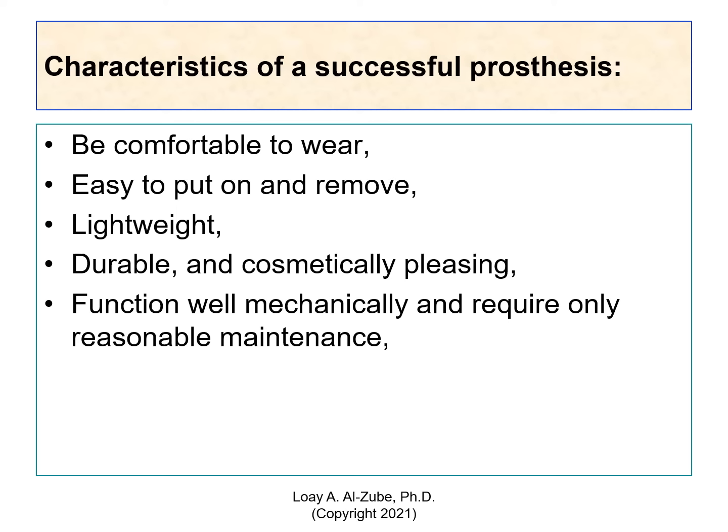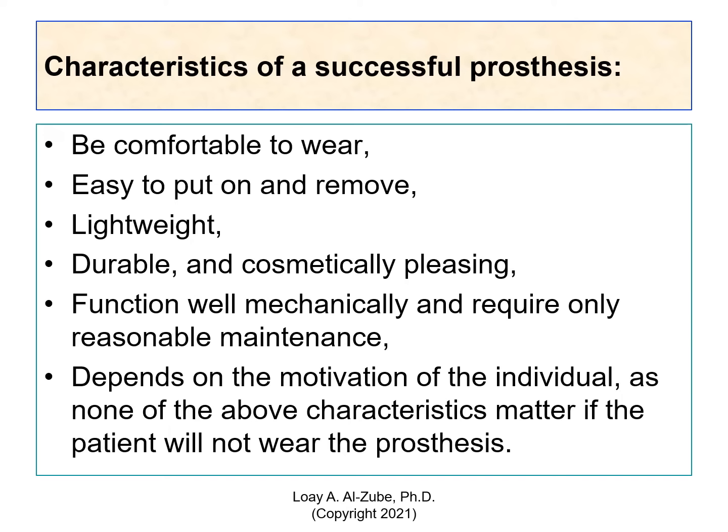And require only reasonable maintenance. That's another thing. Fewer parts, easier maintenance. More parts, harder maintenance. But if you have more parts, you can replace them cheaper. There's a lot of things to consider, and when you do manufacturing and all of the other things. It depends on the motivation of the individual as well. If the individual is not motivated, we're going to fail. So it's very important to make sure that you empathize and understand the psychological situation of the subject.